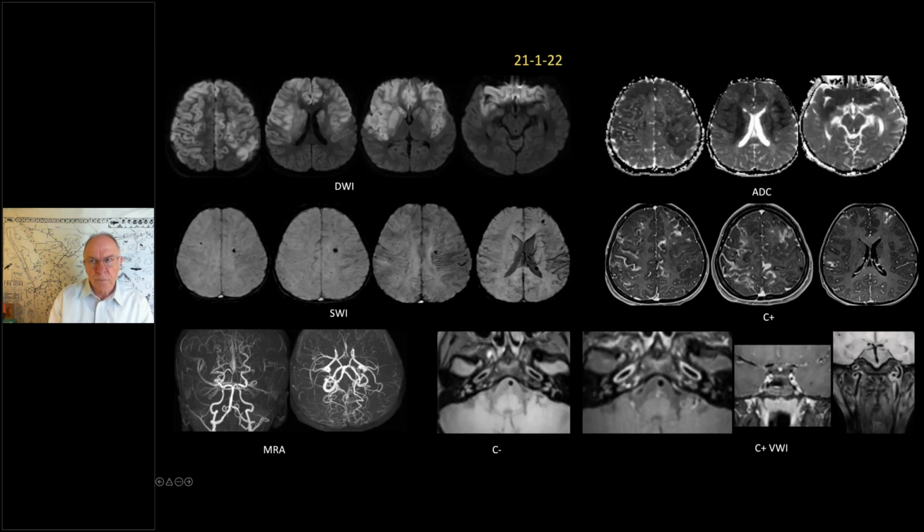It showed bilateral frontoparietal and temporal diffusion restriction with involvement of the right caudate and putamen, with cytotoxic edema. We can see the ADC reversal, and on SWI you can see a bouquet of hemorrhages in the cerebral white matter, with even radiating blooming.